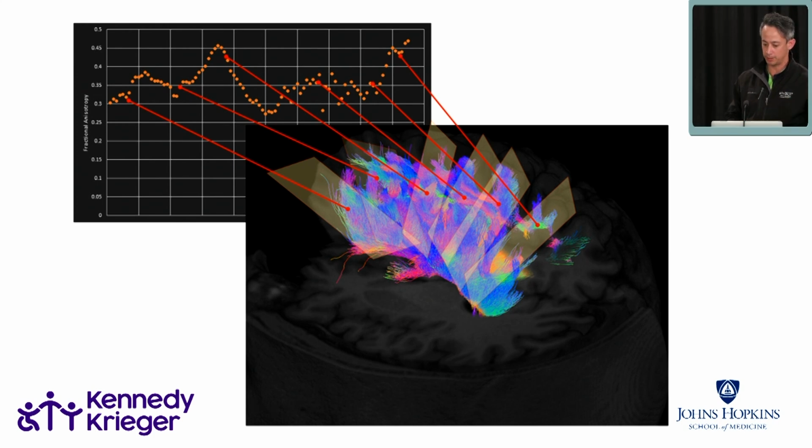So DTI classically puts out 6 major values. For people who are into linear algebra, they're all eigenvectors that are orthogonal to one another, and then you can generate any metric you want. But fractional anisotropy, the measurement of order in the brain, is probably the most famous one and the one that's most used clinically. So we can measure the FA values along the corpus callosum in the normal appearing white matter from within the lesion, then close to the lesion, then getting farther and farther away.